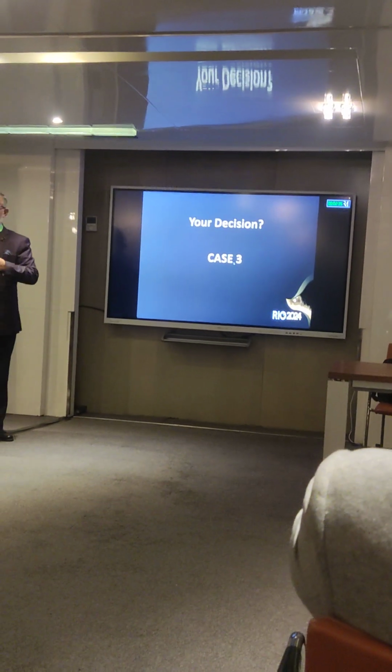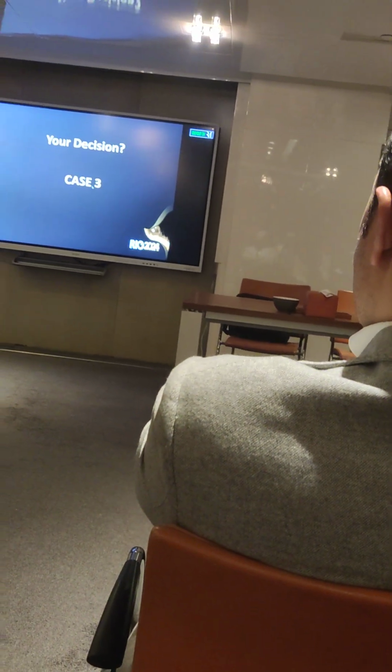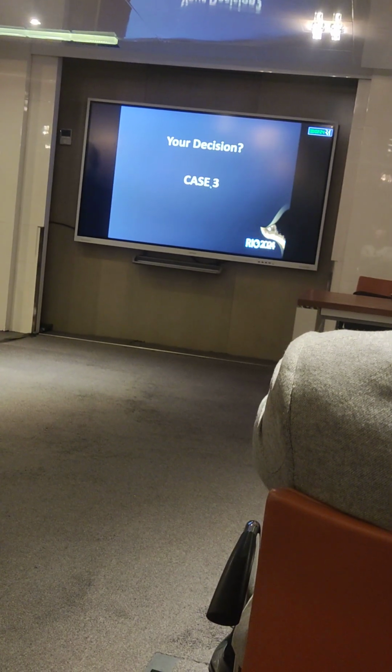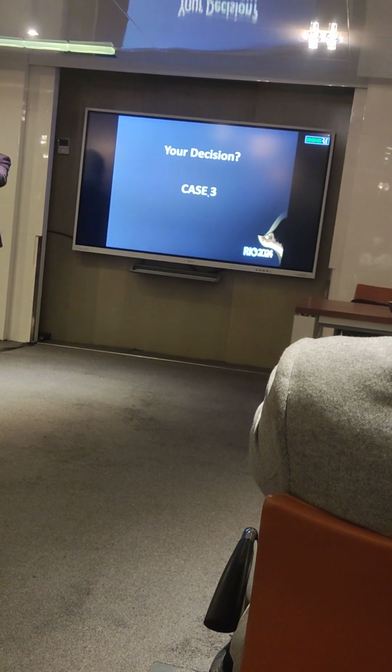And we know that spherical aberration, even the positive, will give some depth of focus. So if you neutralize it with the negative spherical aberration lenses that are available, he will lose this effect. Maybe he will get very sharp and good quality of vision, but he will lose that. So what do you put? Dr. Nabil?